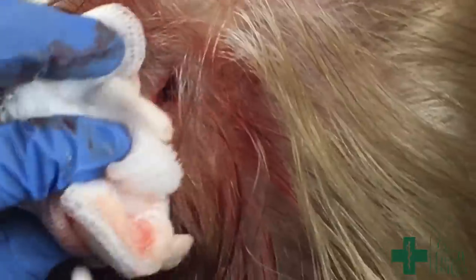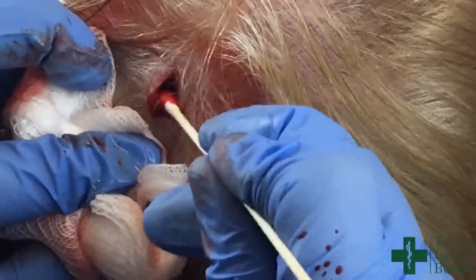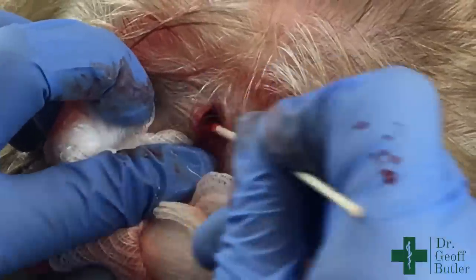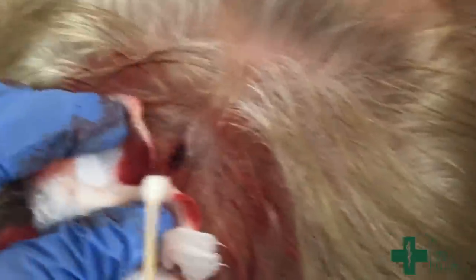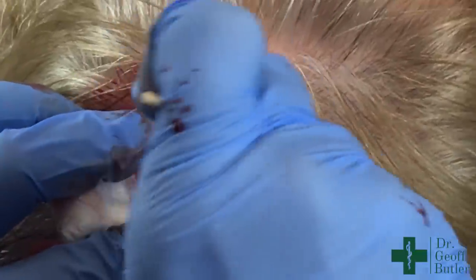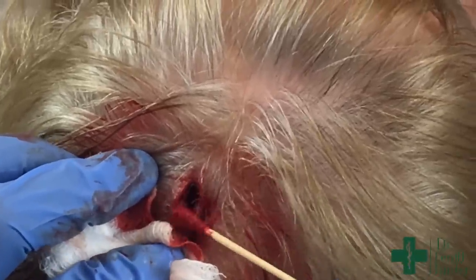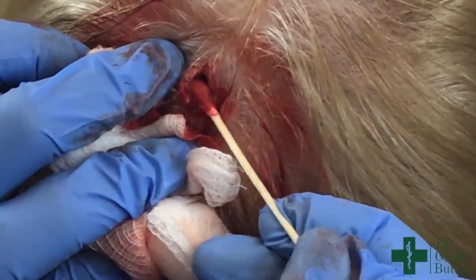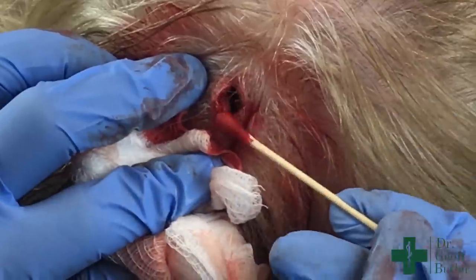This is something I usually do for infected fields — I'm just going to use a longer Q-tip to help clean that out. I'm content that the entire capsule is open; just making sure we're not leaving behind any loose keratin because it evacuated itself into the space. You can see some residual keratin there. Keratin's not infected, so it's not going to create an infection if left behind, but from a healing perspective it'll be a bit nicer if we can clean that out.